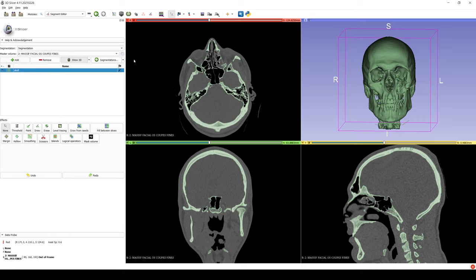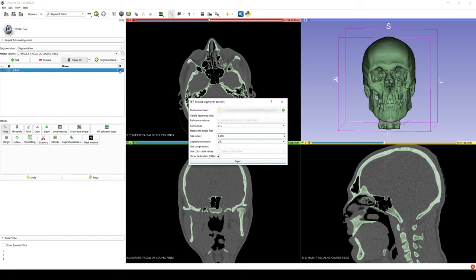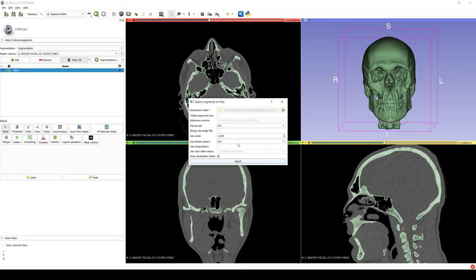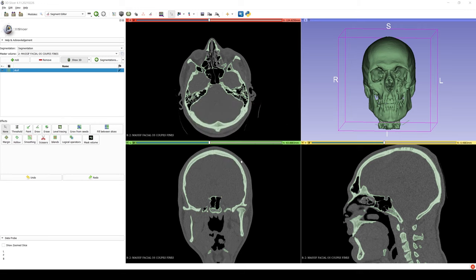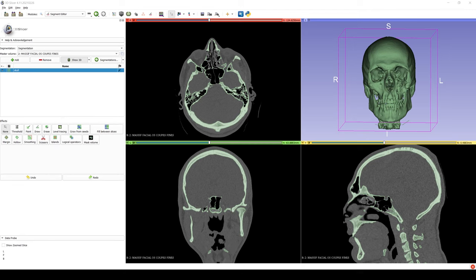The last step is to export the image, which can be done using the drop down arrow by the segmentation tool on the left hand toolbar. The image is then exported as an STL file or an OBJ file and can now be used in a 3D program.